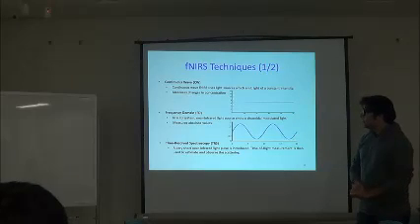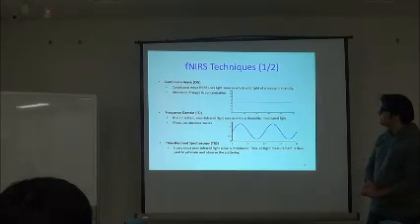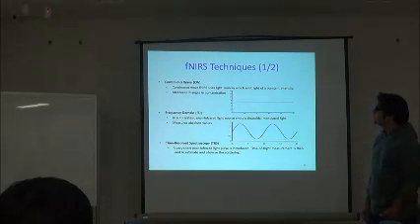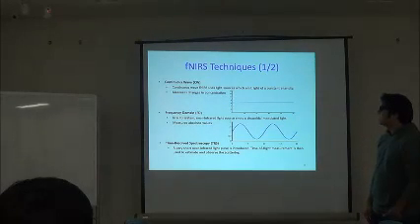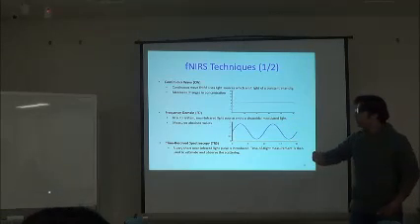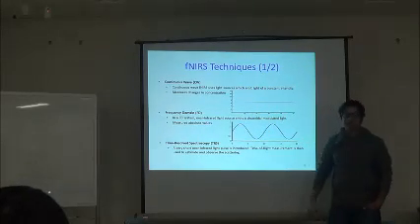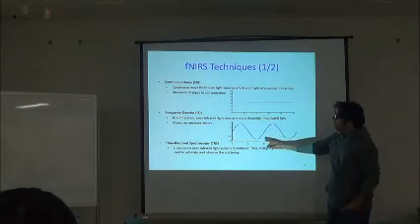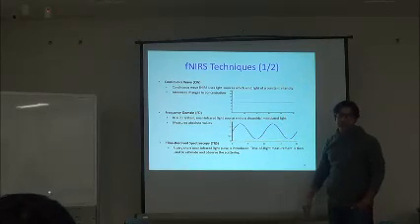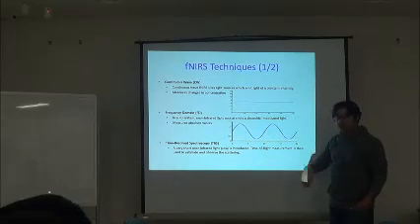In case of continuous wave, a continuous wave of light is emitted. So continuous wave fNIRS uses light sources which emit light of a constant intensity. So the intensity of the light which we incident on the head is constant. It does not change. In case of frequency domain, this same intensity is modulated to some frequency. It's modulated to be made some sinusoids. Why do we do that? I will tell you later.